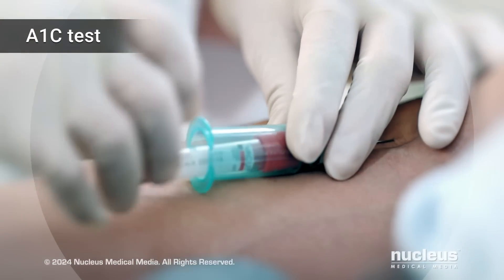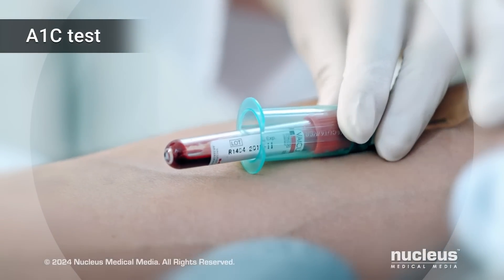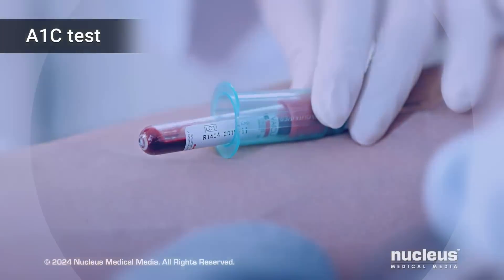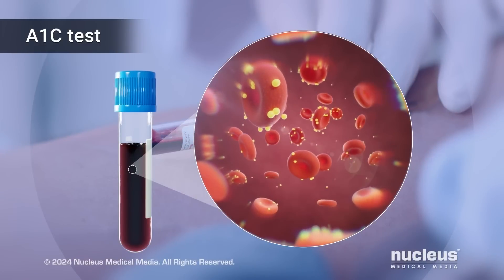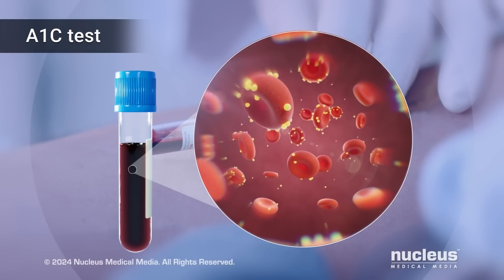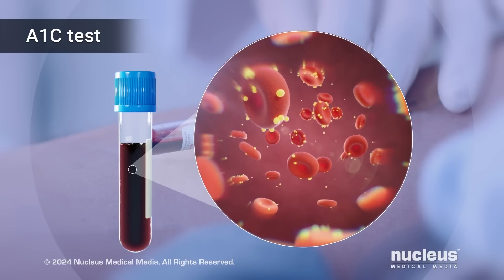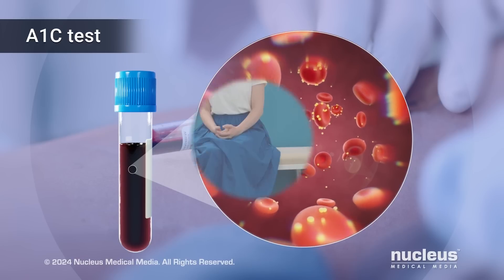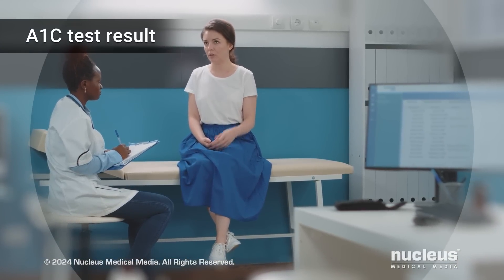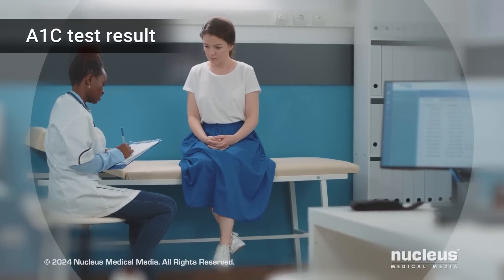During an A1c test, a healthcare professional called a phlebotomist will take a sample of blood from a vein in your arm or from one of your fingers using a small needle. At the lab, your blood sample will be tested to measure the amount of red blood cells that have glucose sticking to the hemoglobin in them. Your A1c numbers, which show the percentage of glucose-attached red blood cells, can be used to estimate your average blood glucose during the past three months.